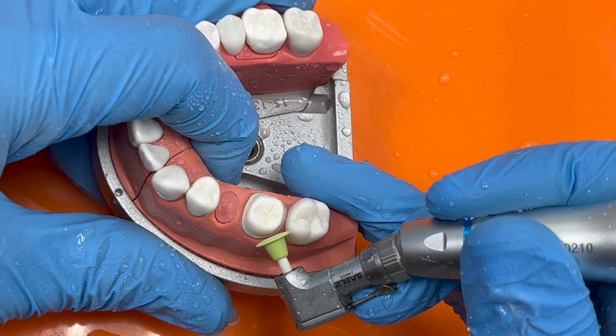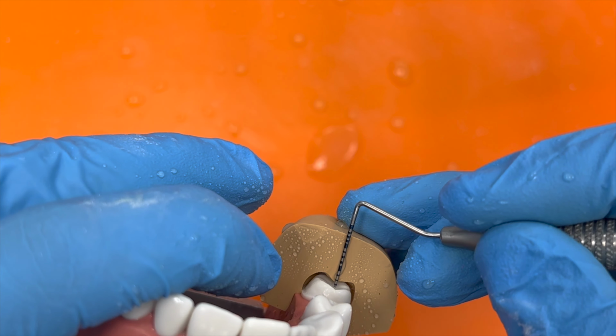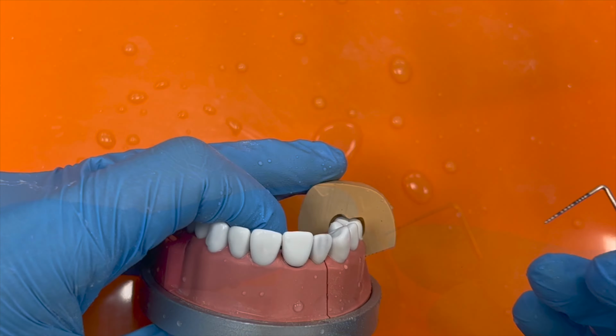It's time to check using the putty to make sure that the reduction is according to the required criteria. Remember, reduction from buccal and palatal should increase or at least stay the same as you go occlusally.